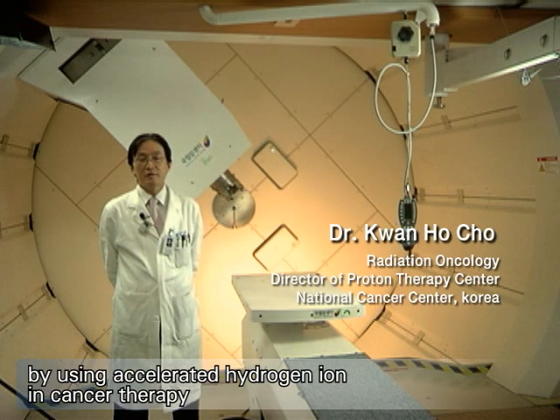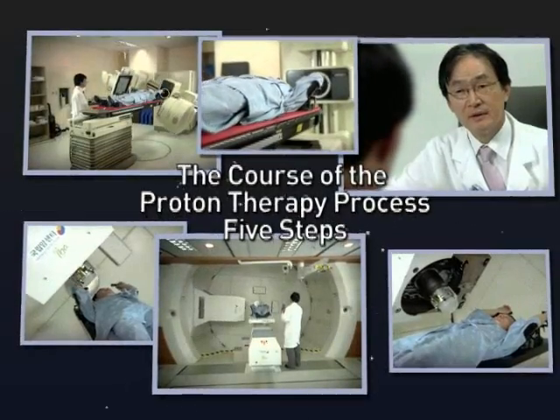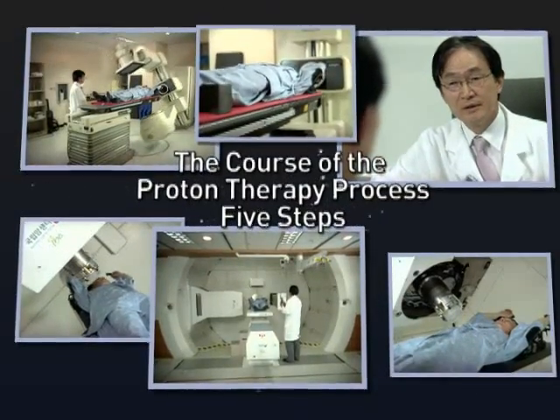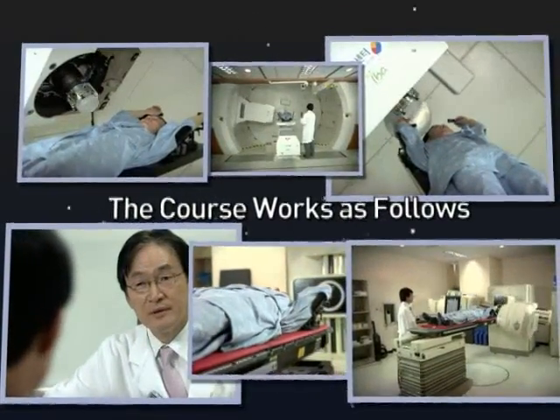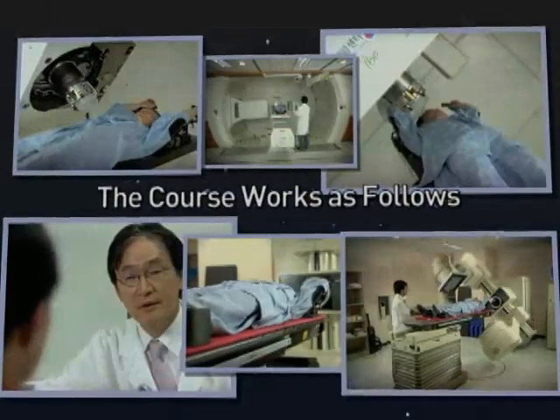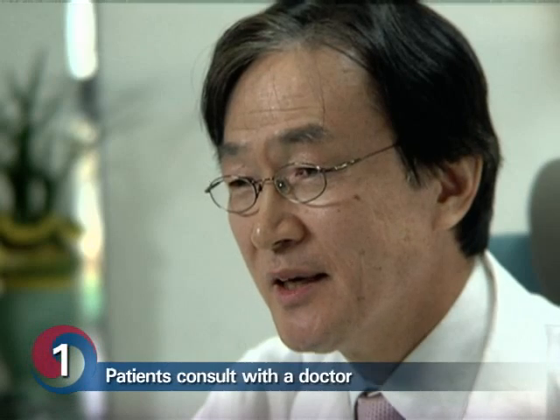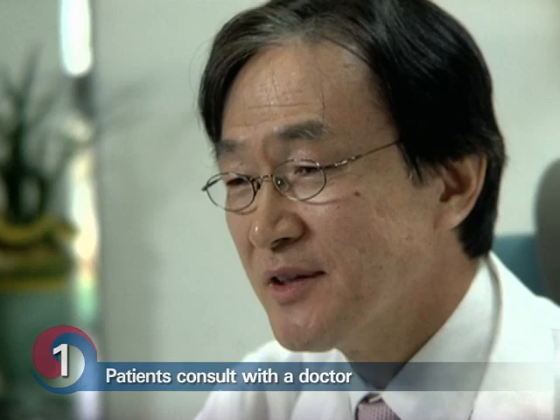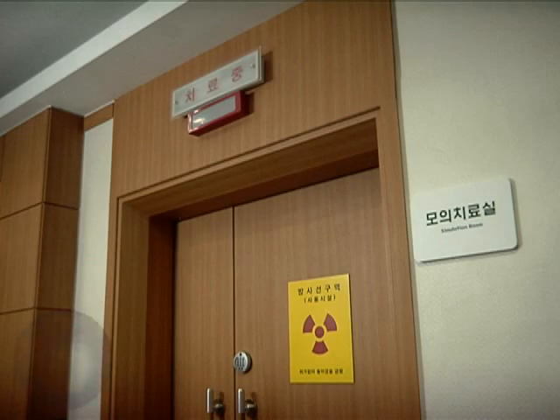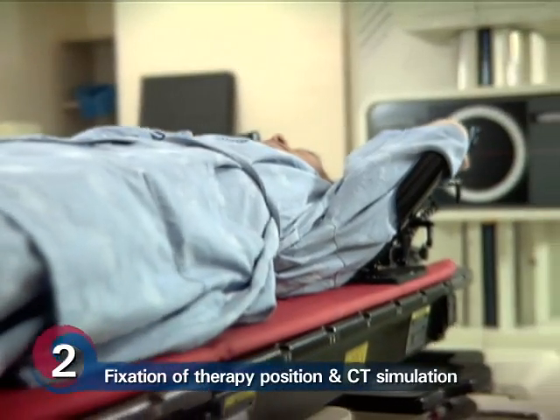In cancer therapy, let's take a look at the proton center treatment course of the National Cancer Center. The course works as follows: on the basis of the medical history, the data was sent to the hospital even before the patient left. The patient was accepted and simulation therapy occurs at the simulation clinic.